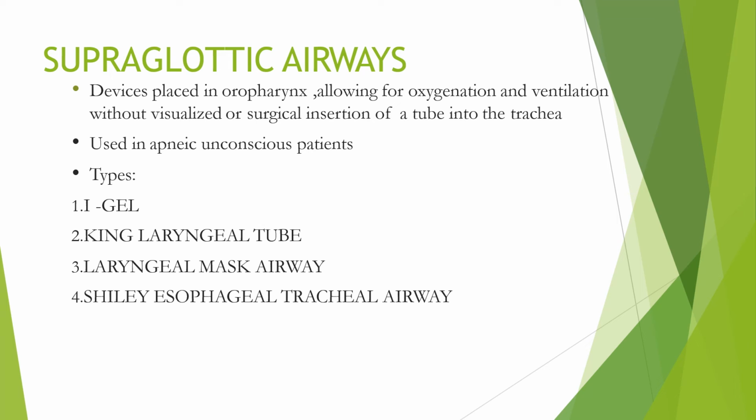There are 4 types mainly. One is the i-gel, second is the King laryngeal tube, third is the laryngeal mask airway, and fourth is the Combitube esophageal tracheal airway.